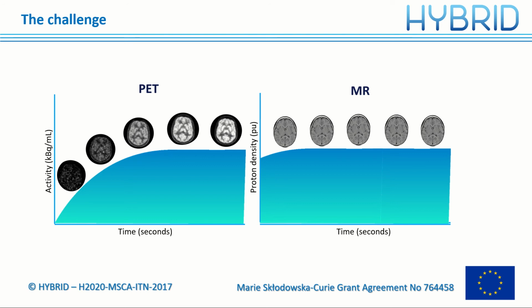In an integrated PET-MR, sparse MR navigators are required to detect motion, and we can apply the motion vectors to align the PET images. In the PET-CT, we can only register directly the PET images at different time steps to compensate motion. But this will not work. Why? Because as we can see from the graphs, the activity distribution in PET frames during the scanning is changing, while in MR navigators, image information does not change drastically. Standard registration algorithms do not work if the images do not have enough structural and feature information.